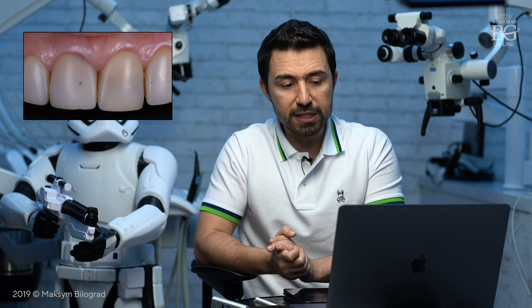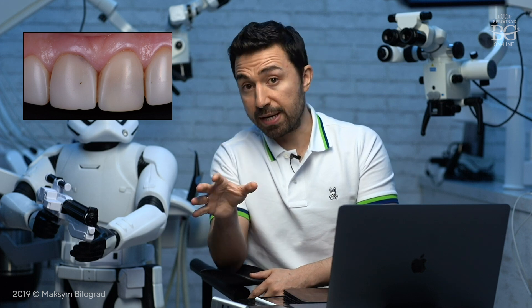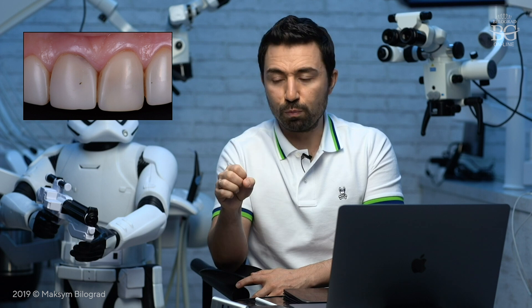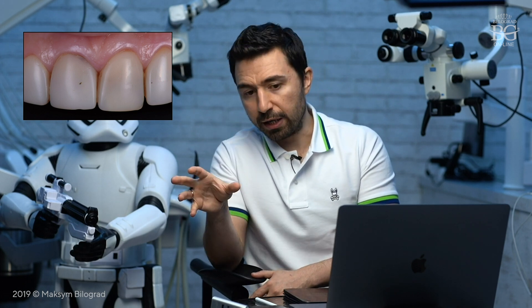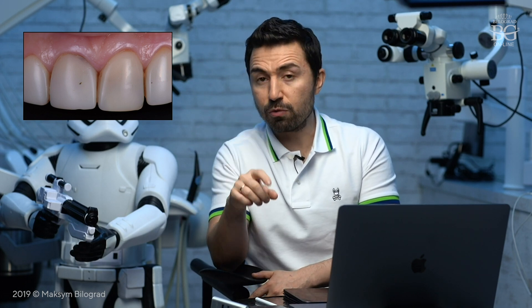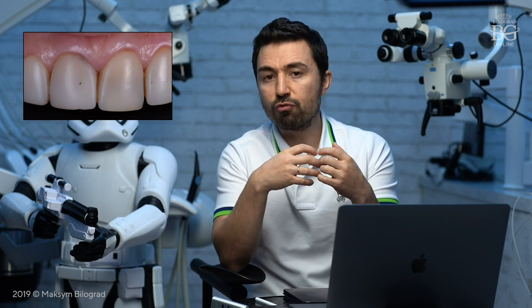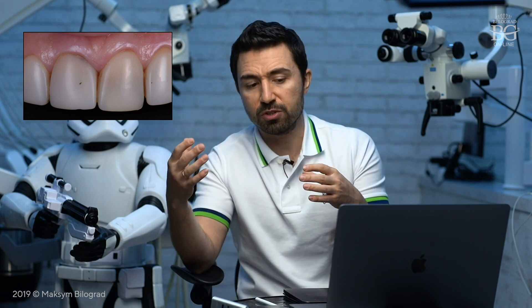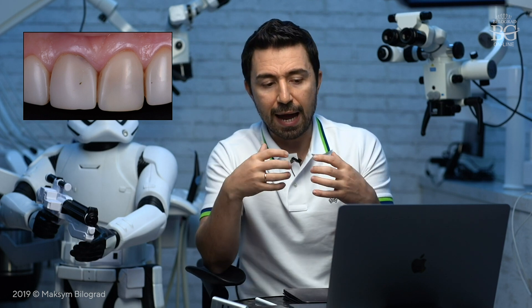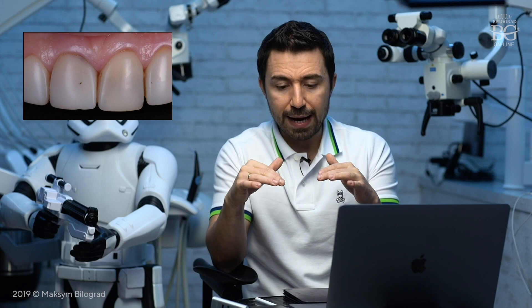Before I start the step-by-step explanation, I want to mention that I'm not a dentist who preps every single case with rubber dam. I'm a big fan of rubber dam and will place it everywhere I can, but it has to be used in a practical way. I use rubber dam when teeth have caries lesions, caries defects, necessity to replace restorations, immediate dentin sealing, cavity design optimization, or an endodontic issue — in these cases, rubber dam is a must in my protocol.